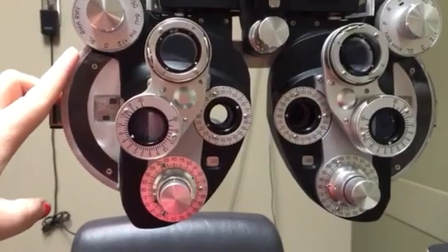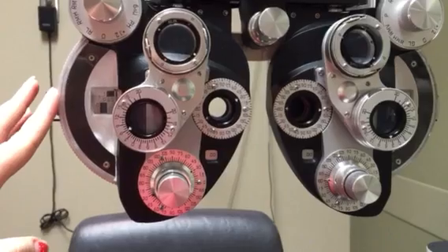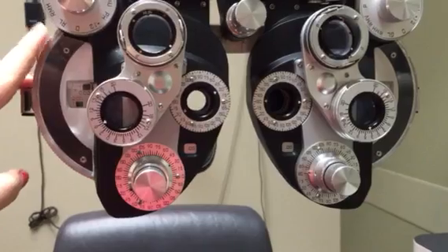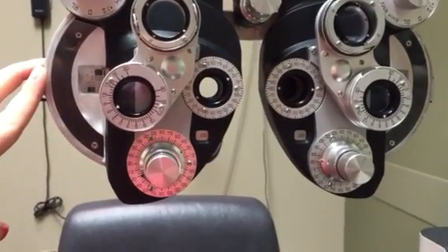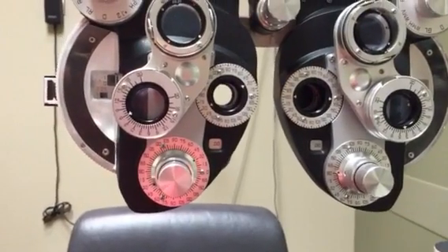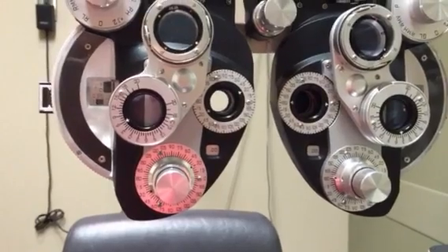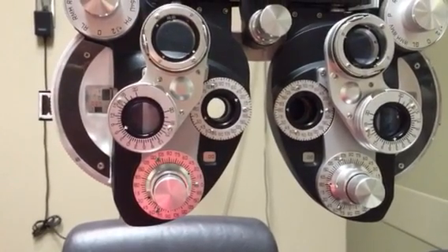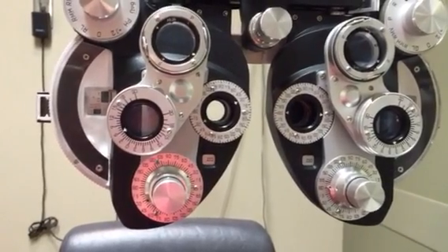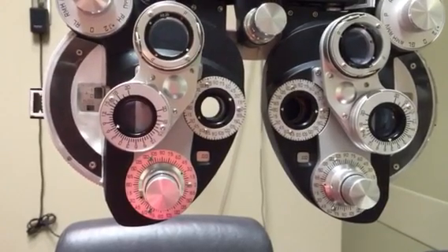We'll start with sphere, usually going in the plus direction to begin. If the patient says it's worse or about the same, go back to plano. One quarter of power equals one line of change, so if they're 20/25 that's one line off 20/20 — about one quarter of change. Adjust accordingly if they need more.